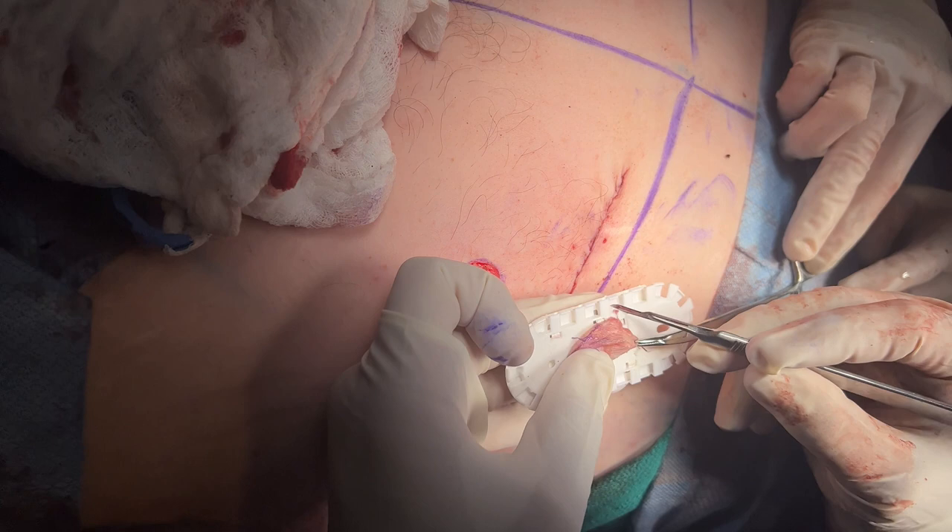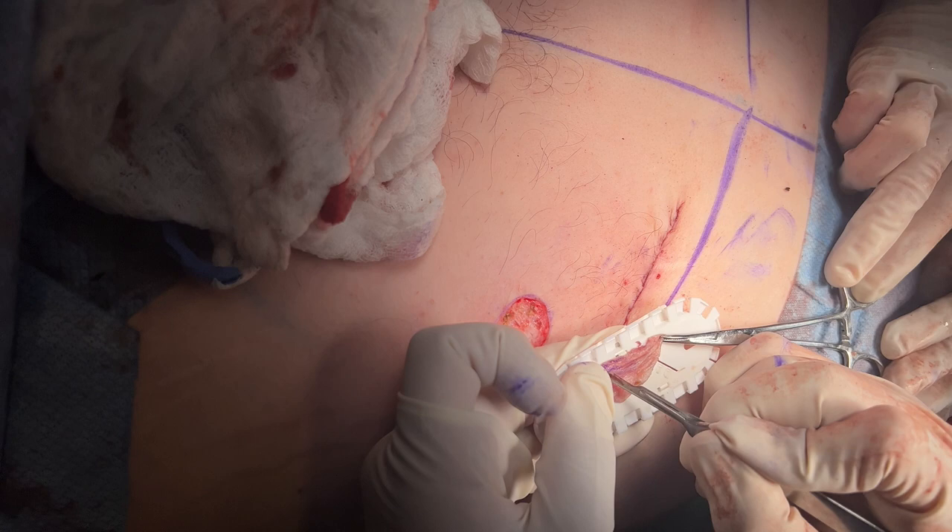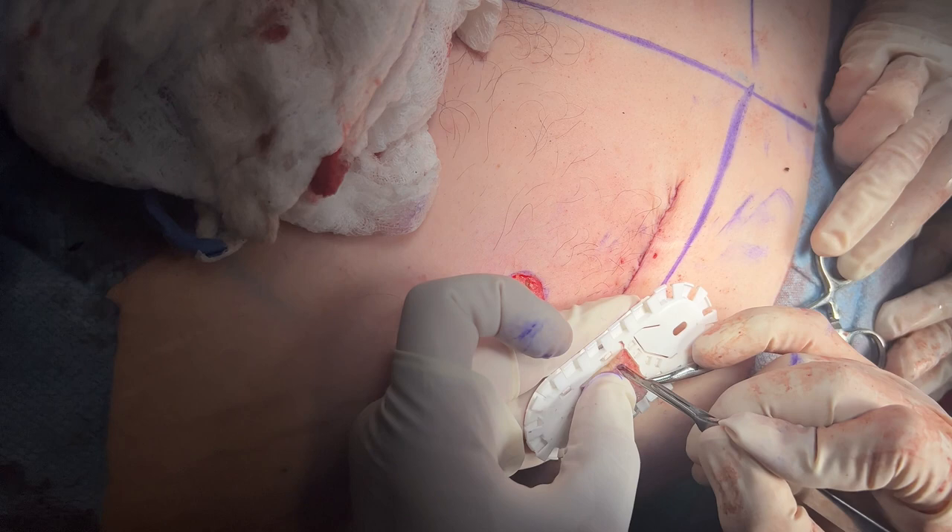In order for the graft not to elevate and get stuck, you have to make little holes in it. Usually we mesh it when it's bigger, but with something like this we just make little stabs in it.